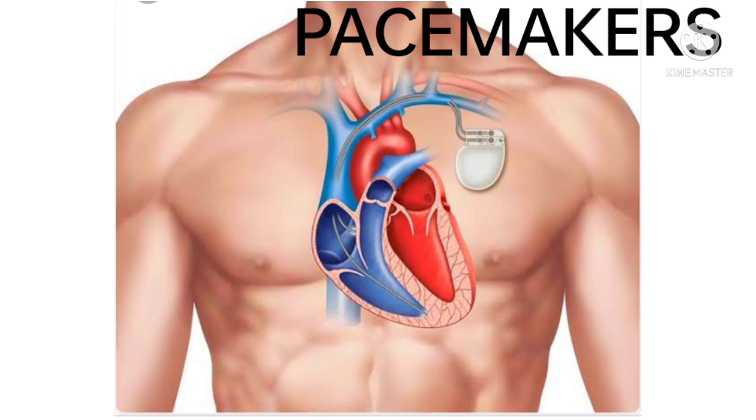Pacemaker function. The cardiac cycle normally begins with the client's own beat. The pacemaker sensor senses whether the intrinsic beat has occurred. If not, the pacemaker sends out an impulse to begin myocardial depolarization through a pulse generator. The impulse generator is said to capture the myocardium and thereby maintain heart rhythm. Limitations: the LCP pacemaker is not appropriate for patients requiring dual chamber sensing and pacing. There is a possibility of device dislodgement and migration into the pulmonary vasculature.